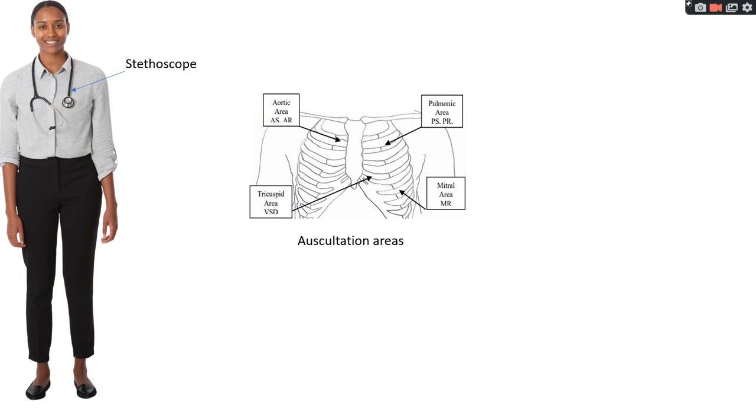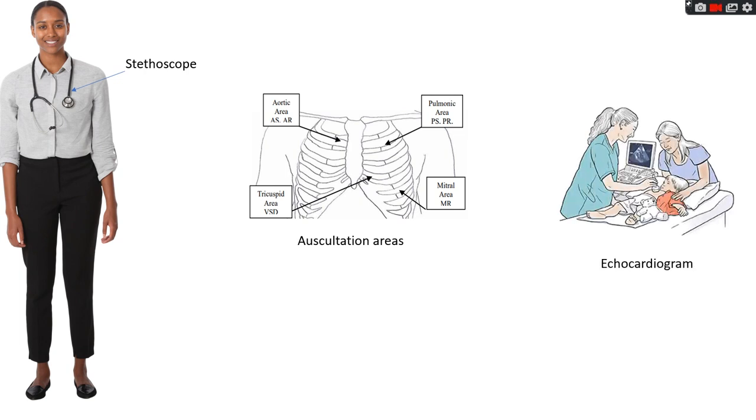Hence, cardiac physicians apply further assessment such as echocardiogram scan. However, this echocardiogram scan is expensive. Hence, cardiac physicians require enhanced technology to get faster and cheap diagnoses.